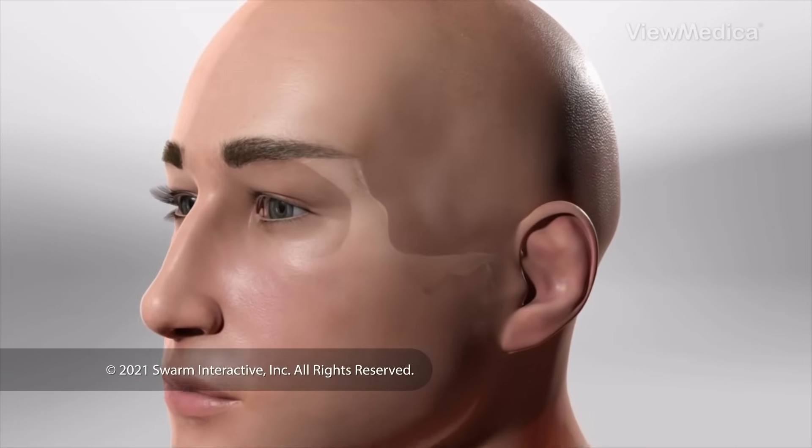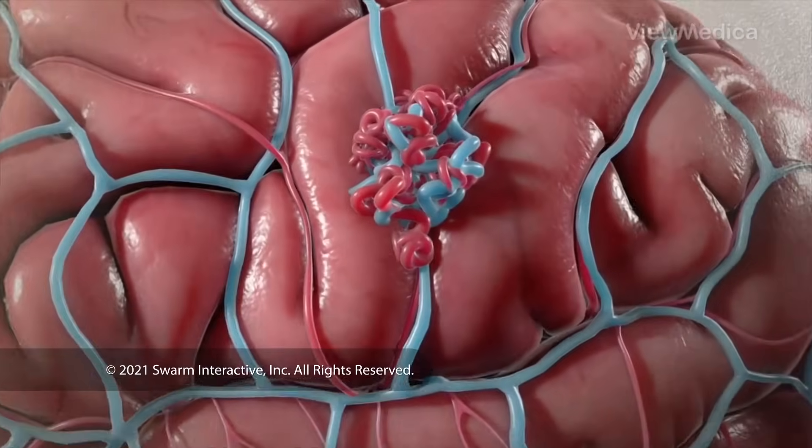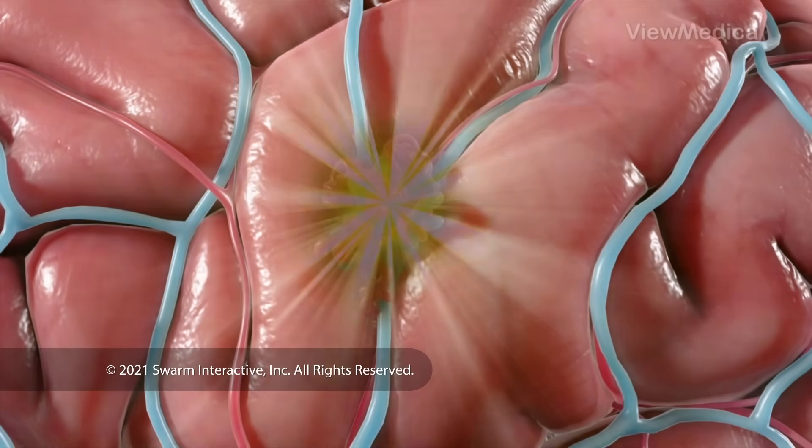This is a way we treat a tangle of blood vessels called an AVM in your brain. It uses focused beams of radiation to shrink and destroy the AVM without needing an incision.